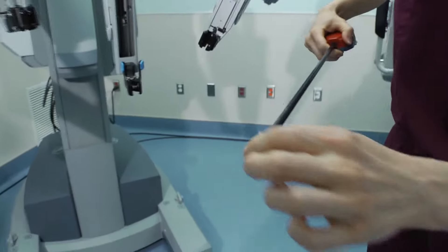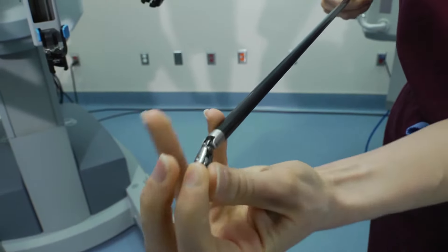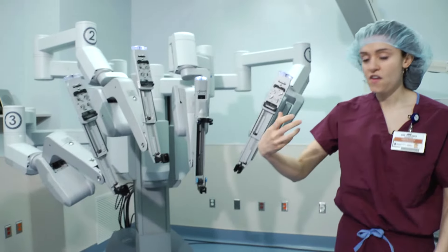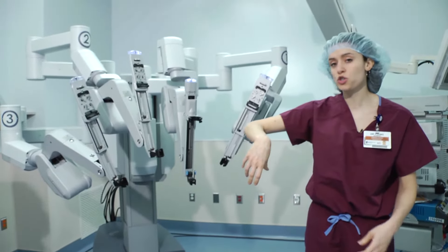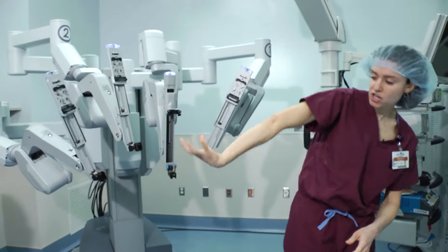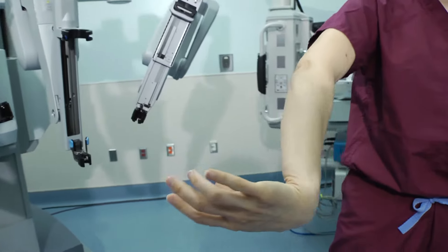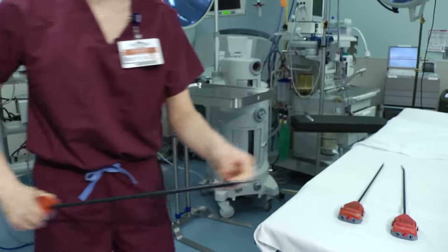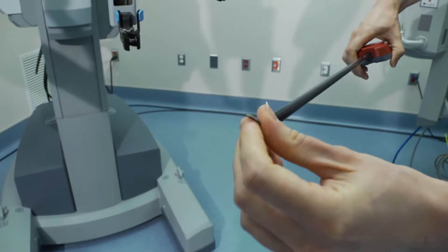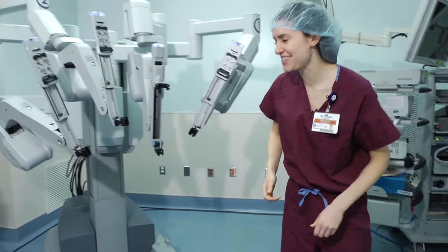The da Vinci wrist demonstrates wristed motion like this — you can't do that with laparoscopic surgery. In fact, the da Vinci wrist is superhuman, or super physiologic. The da Vinci wrist can go approximately 720 degrees, where the human wrist maxes out well short of that. The da Vinci wrist can achieve more than twice the rotation of a human wrist when you're inside the console. That just sort of makes you a superhuman surgeon.